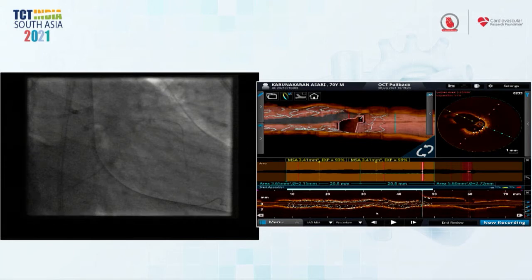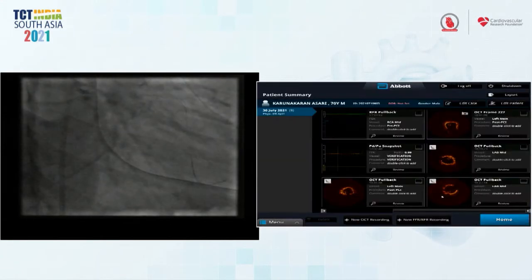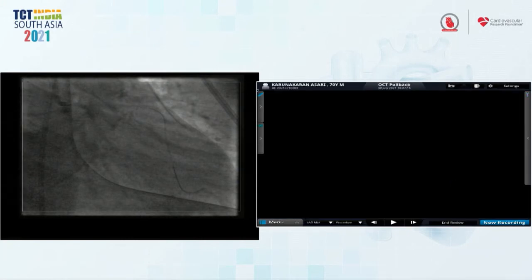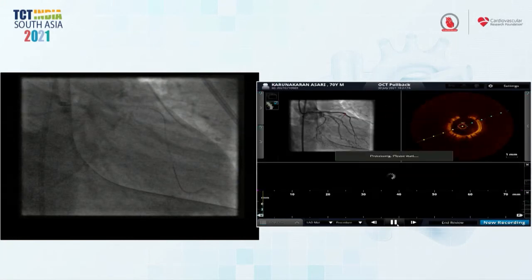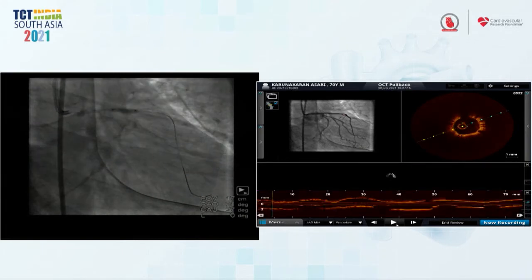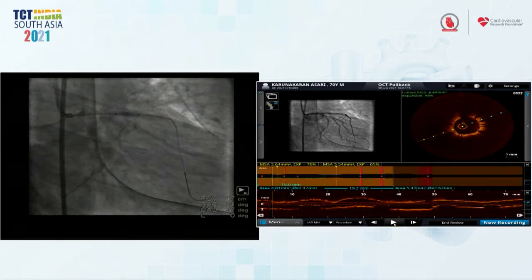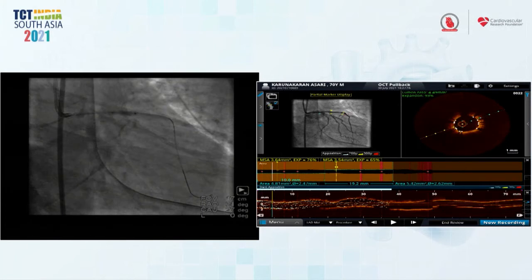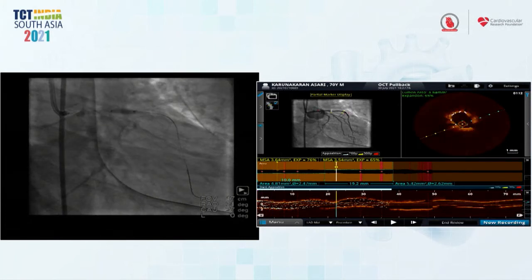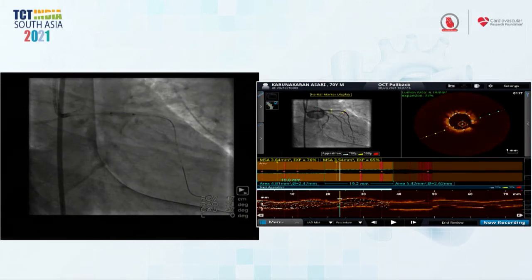What do you think? So did you dilate the proximal vessel? Actually, we dilated again with the same 3.0 scoring balloon at the same spot. Just show the next OCT, please. So we were a little unhappy about that. You can see the pictures also. There's something on the down part of that balloon. Can you see that? Yeah, that's clearly under expanded there. So we went up with the 3.0 scoring balloon just to be sure that we get the best out of that lesion. We got some benefit, but not great. It just improved to 3.5, not much.